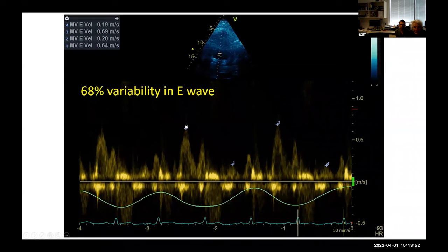And then we have got E-wave variability of more than 68%. So that is sizable. Yeah, it's a lot.